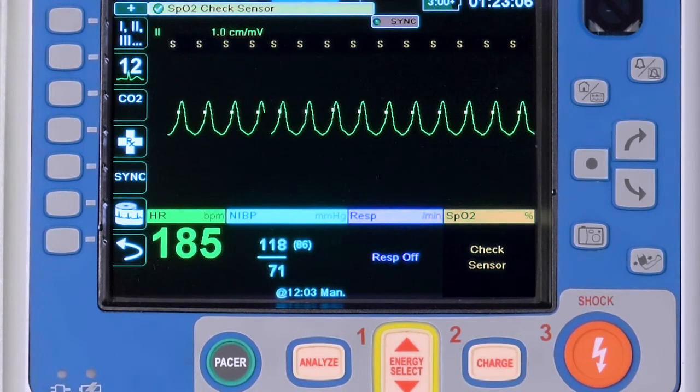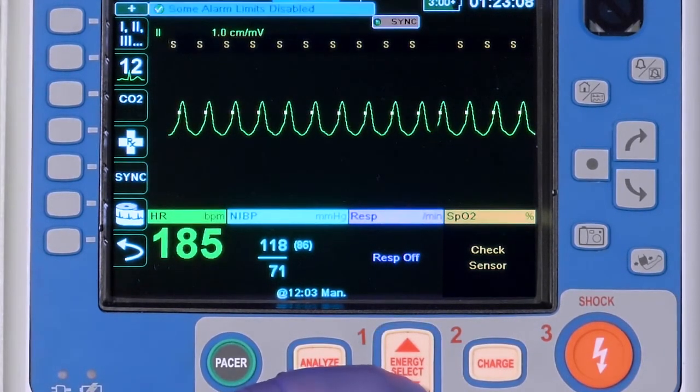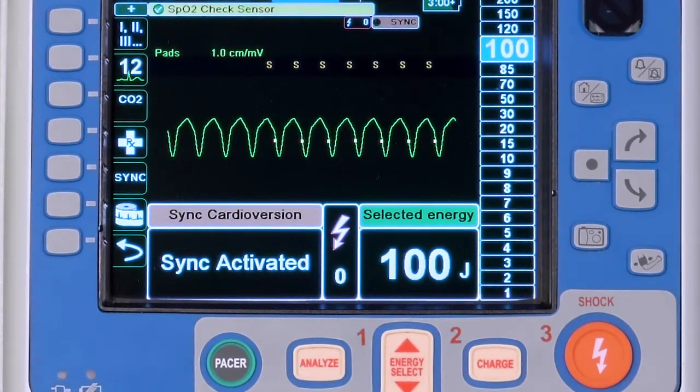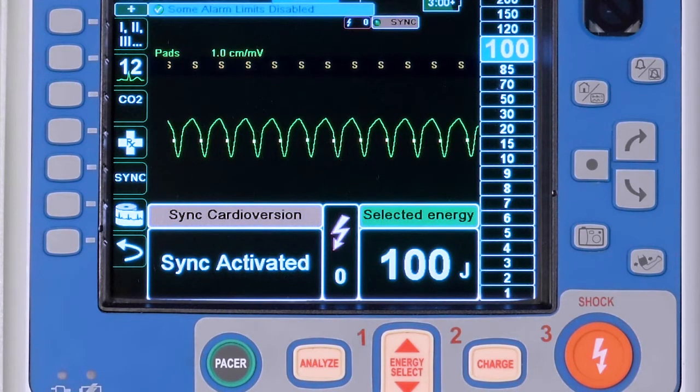Once Sync mode has been activated, select the button labeled Energy Select to set the desired cardioversion energy. This setting will be cardiac rhythm dependent. Refer to local clinical protocol or medical direction.